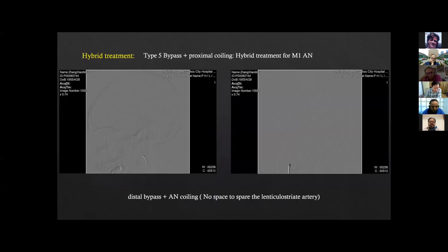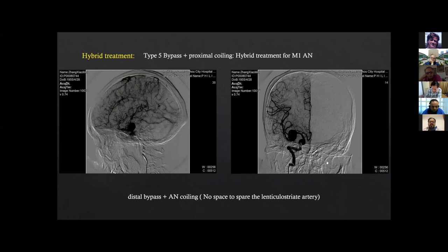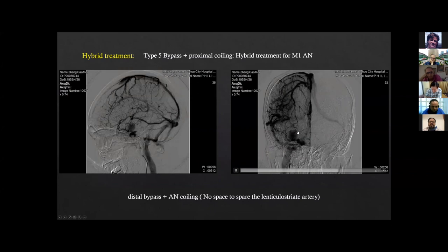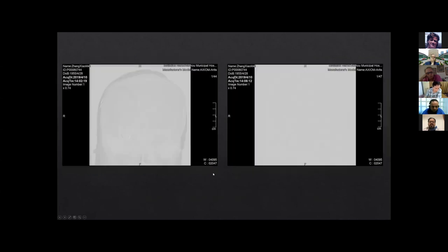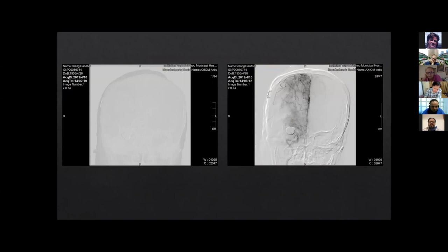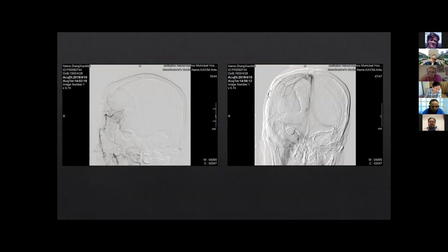Sometimes we can even use a hybrid treatment. This is an M1 segment big aneurysm where the LSA originated very close to the dome of the aneurysm, leaving no space to achieve proximal clipping. So I used coils to achieve proximal control of the aneurysm. We can see all the perforators were protected very well, the distal bypass was patent, and blood flow returned to the M2 segment.